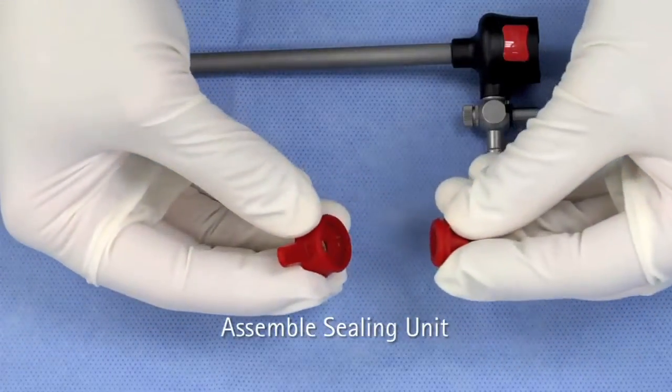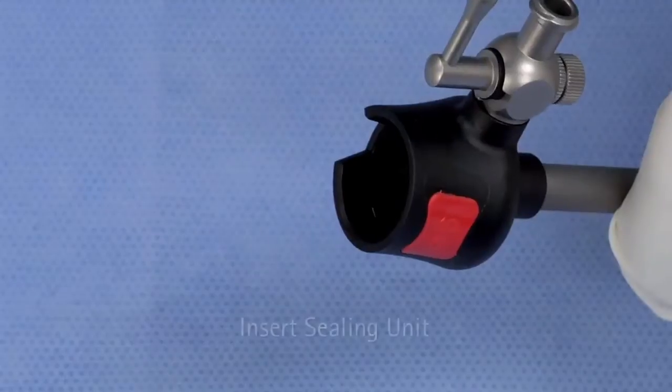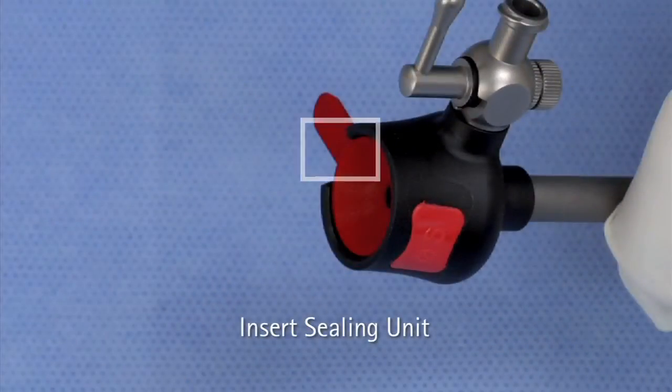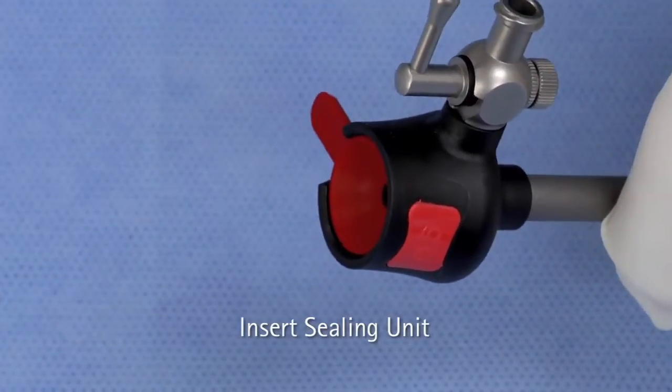Attach the cross-slit valve to the bottom of the sealing unit. Insert the assembled sealing unit into the trocar sleeve. The sealing unit tab should be aligned with the opening in the rim of the trocar head. Firmly press the center of the sealing unit to ensure it is securely positioned.